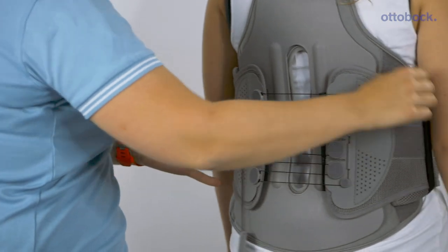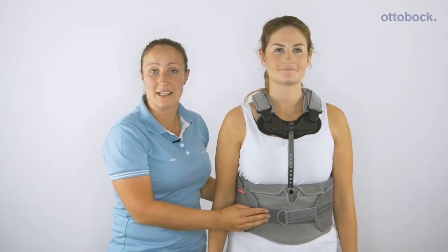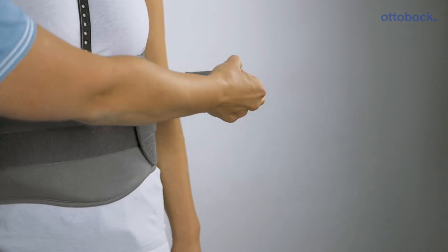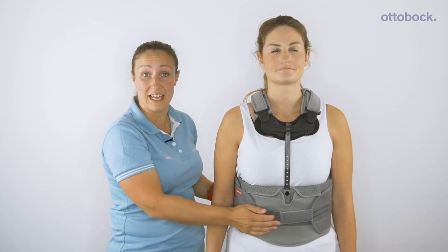All of the pads are removable and can be washed for patient hygiene. The SI, lumbar, and thoracic braces feature the single-handed pulley mechanism that is easy for patients to don and doff, and it applies individual compression to a patient's anatomy.